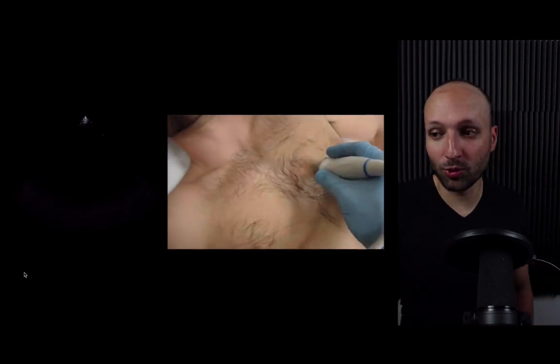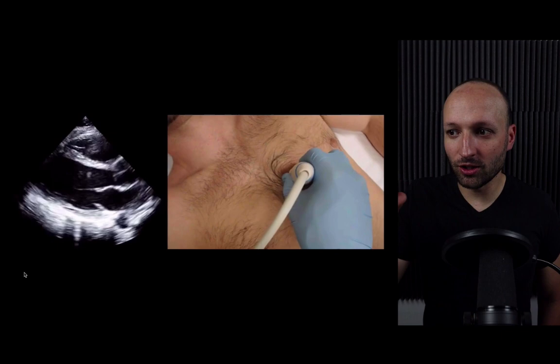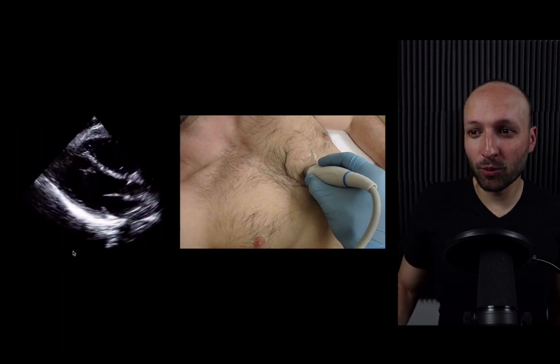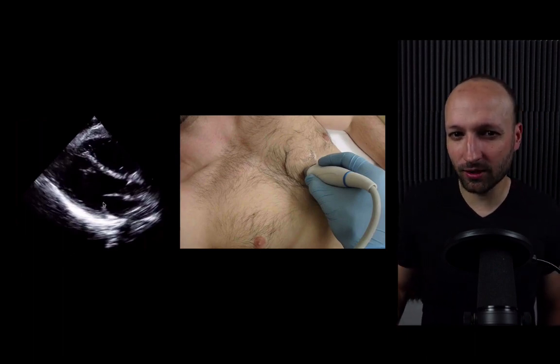Now, we talked about getting a good parasternal long axis view, that you want to do little big movements, big circles, and then little rotations. It's a good move.